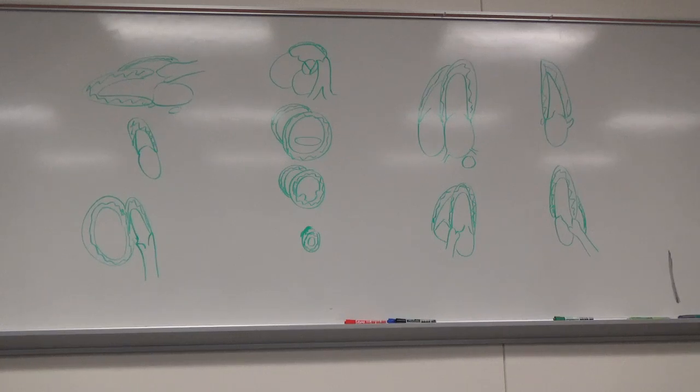So today I kind of want to talk about the echocardiogram, what we're looking for, what we measure, all that kind of stuff. So first thing is knowing the anatomy is going to be the most important part.